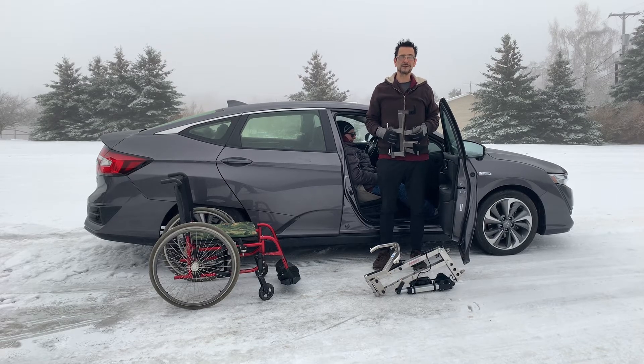Hi and thanks for tuning in to Access Unlimited's YouTube channel. Today we'd like to introduce you to the Multilift Personal Transfer Lift System, shown here for use in the Honda Clarity in the passenger front position.